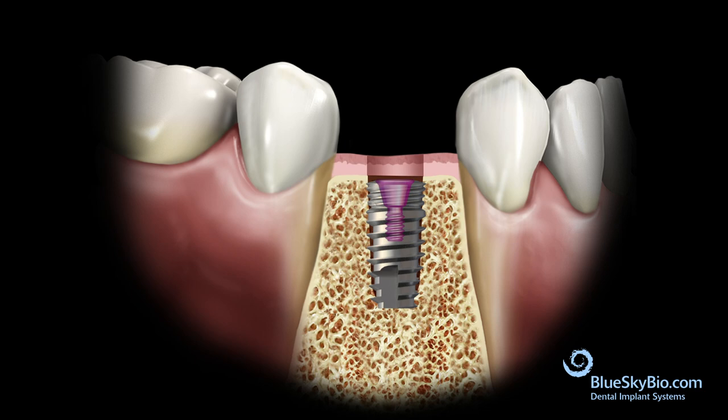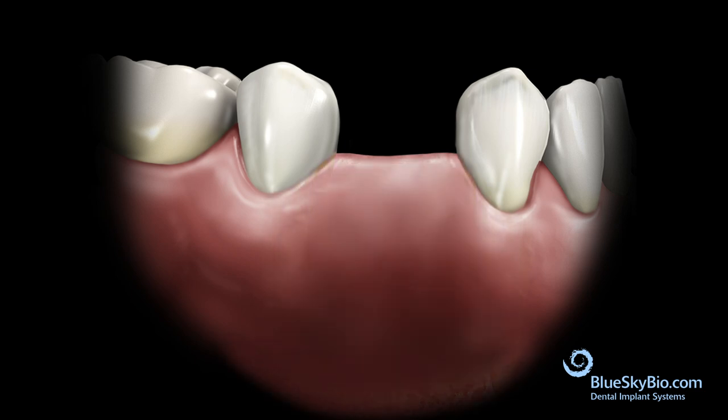The cover screw is inserted into the implant and the flap is sutured. Adequate time is allowed for the implant to integrate.